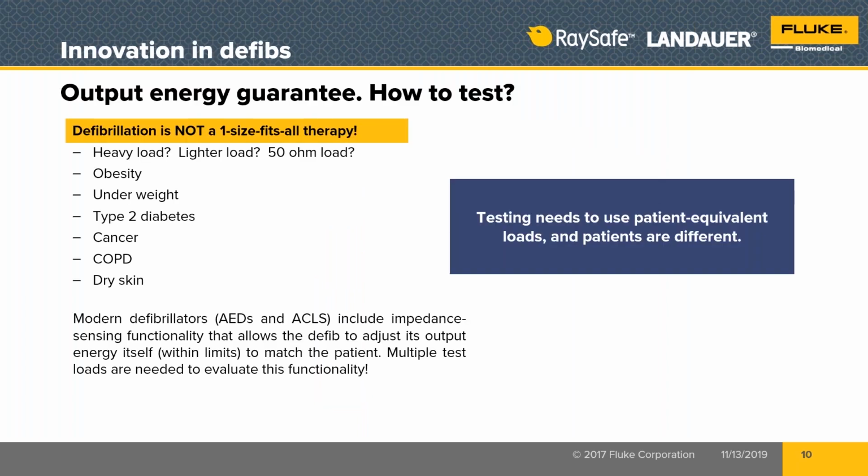Hey, Jerry. We just had a gentleman ping in here saying that their defibs are tested every day. You're right. In most medical facilities, they do a daily check on all your crash carts and your defibrillators. But are you really going through all the parameters when they do that? Or are they just powering them on, making sure it powers on and the battery's full and the pads are still in service?